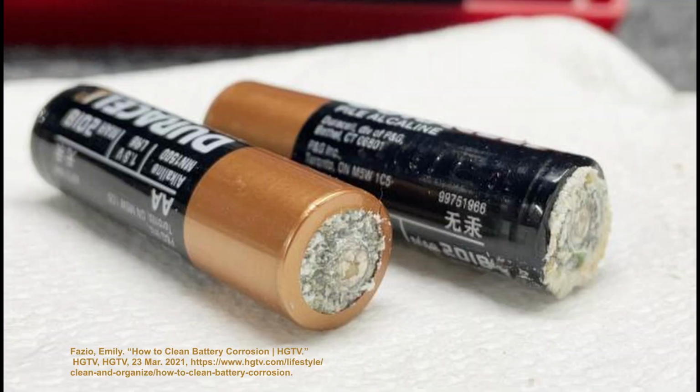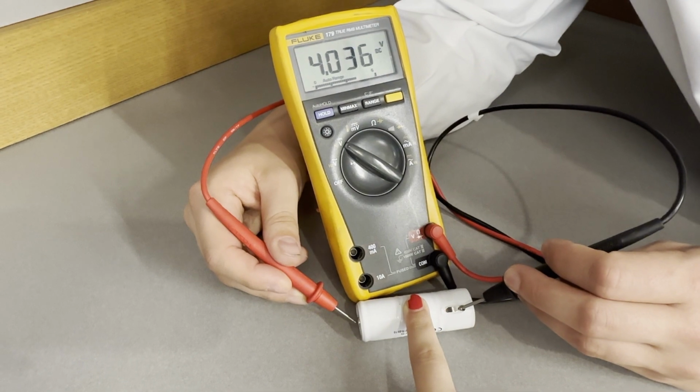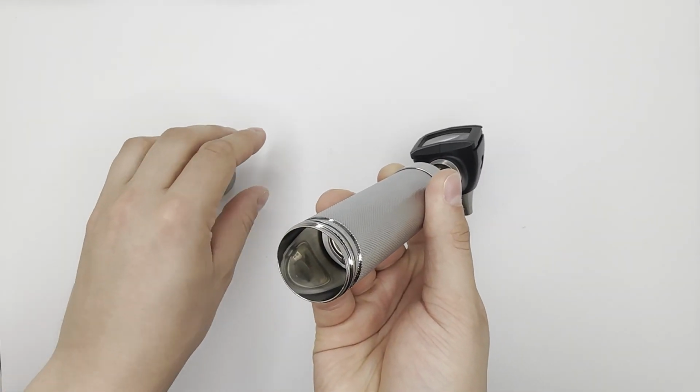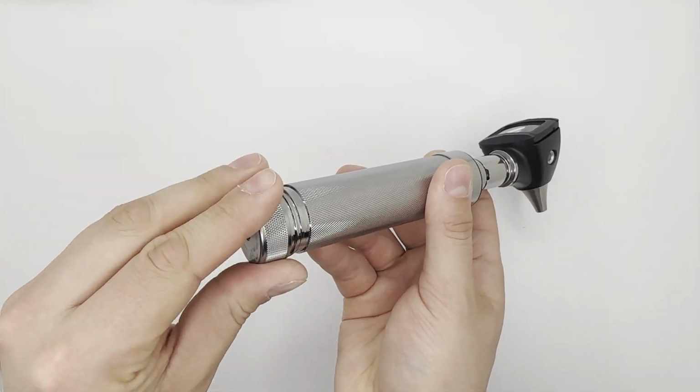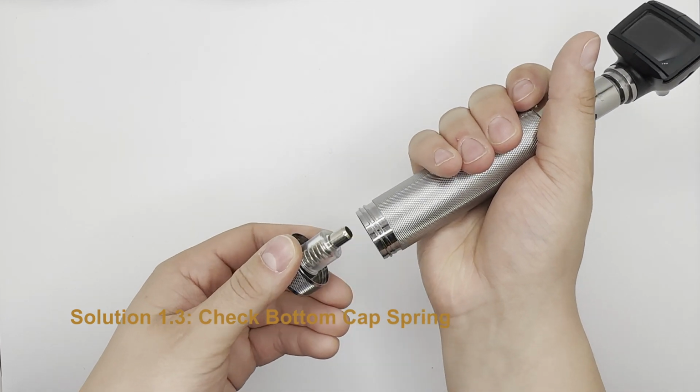Check for signs of visible corrosion. Use a multimeter to test that the battery still carries a voltage difference. If the battery is damaged or can no longer hold a charge, a new battery may need to be purchased. With the bottom cap removed, check that the bottom cap spring is present.